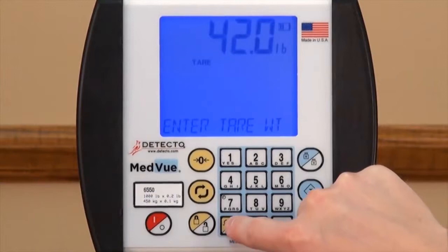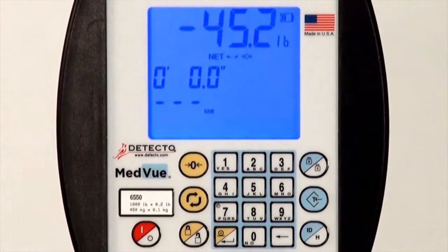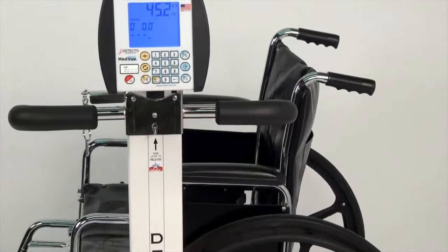If you know the weight of the wheelchair, simply enter it on the keypad and select to tare that weight. If the weight of the wheelchair is not known, it may be subtracted by placing the empty wheelchair on the scale and pressing the yellow zero key. The 6550 can display weight in either pounds or kilograms, selectable by pressing the yellow unit switching key.